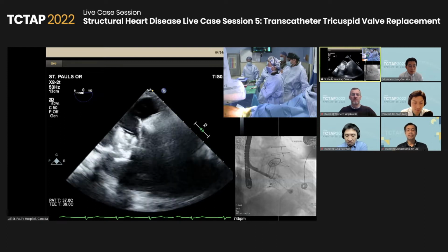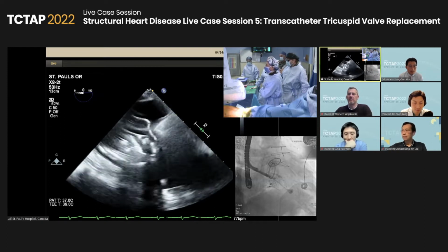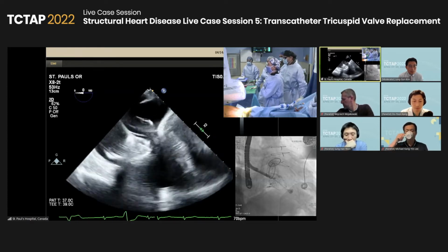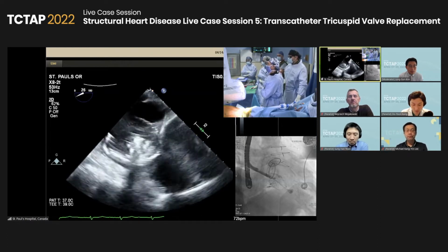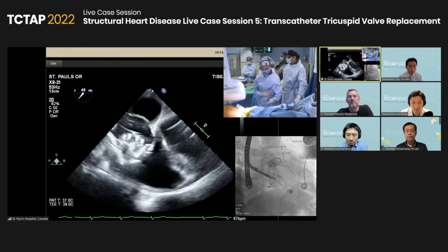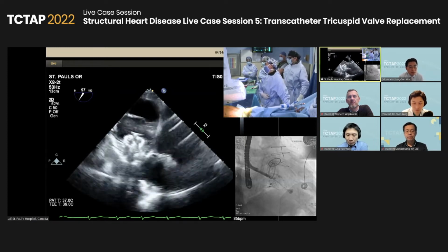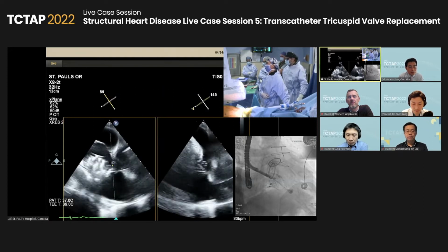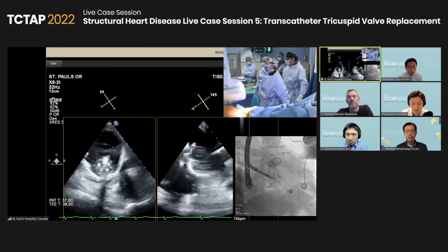There, we just see if we can find the septum and the tongue itself. Let me just go back to maybe the X-plane view. We'll have a look there. On that particular view, I'm sure you can appreciate that the atrial skirt is super angular and wide open. We had the color there earlier, and we can see very little valve leak.